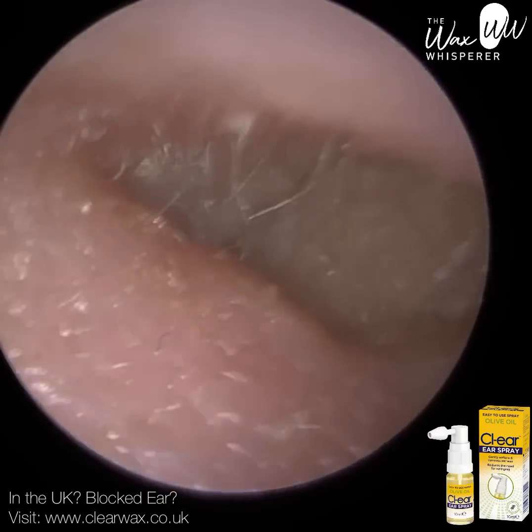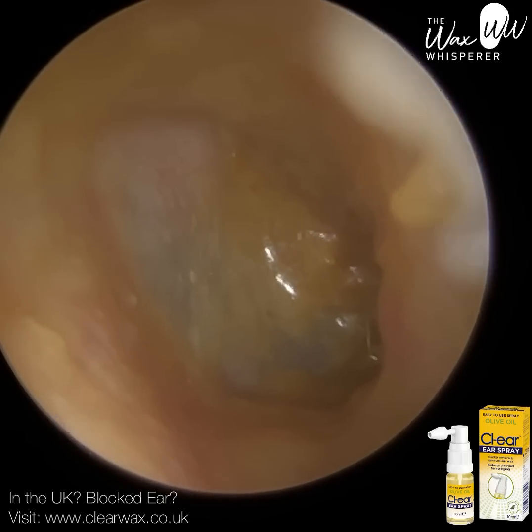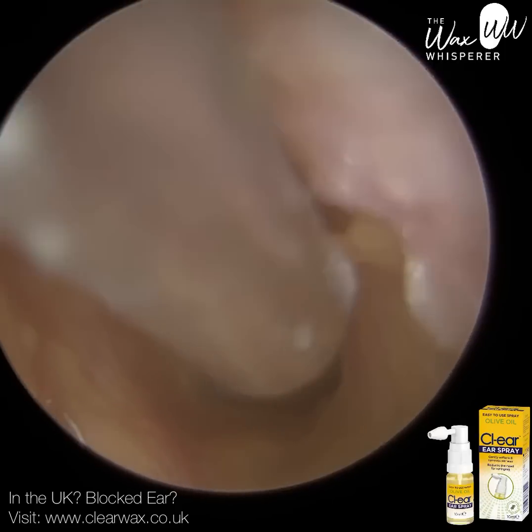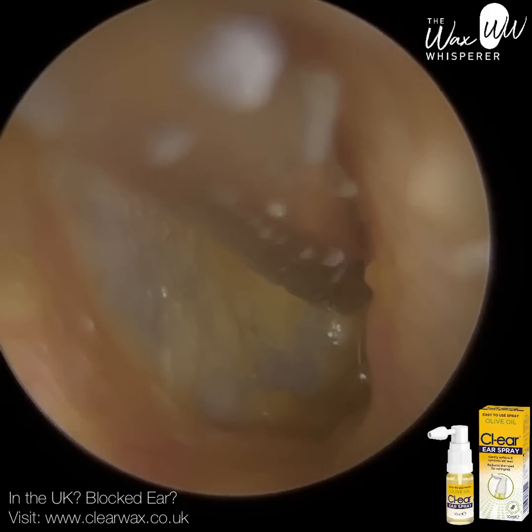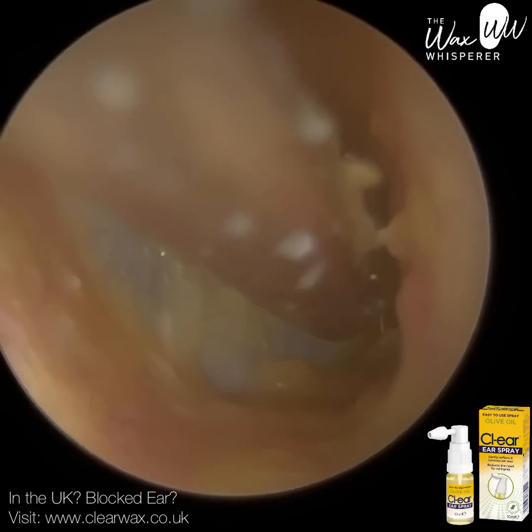This patient has got a really bendy, narrow, twisty ear canal. Previously when they attended, I think it was about a year ago, it was really difficult to remove the wax because of the ear anatomy, but also because it was really rock solid. It was embedded onto the eardrum. You can see this patient's just got earwax on their eardrum, and it was really difficult to gain access.